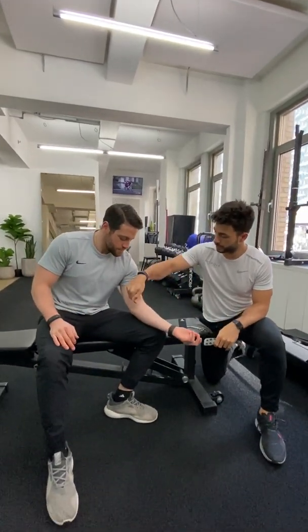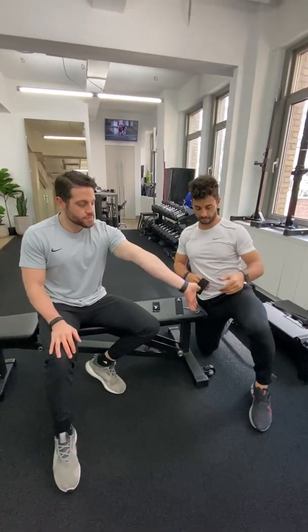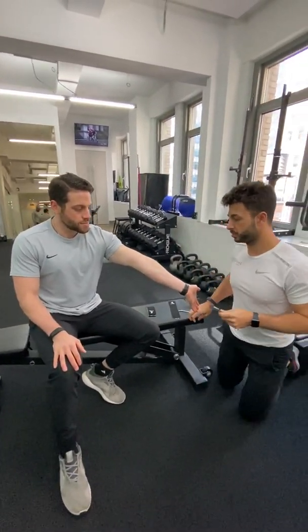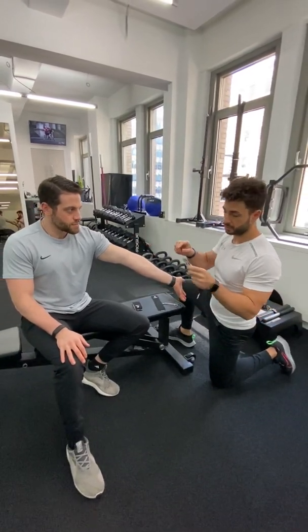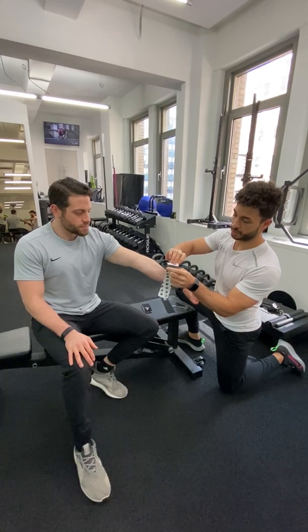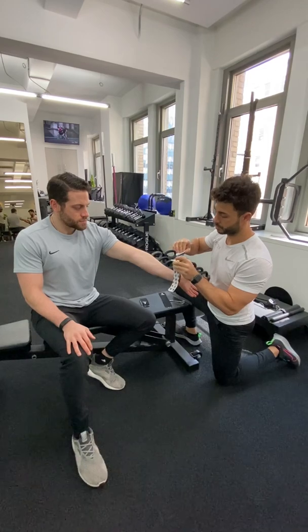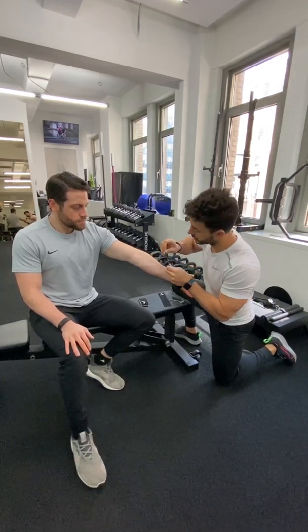So what we're going to do, we're going to really work on his medial elbow. We're going to have him just lift his arm straight out and then bend the wrist down and do a little stretch here. So what I like to do is I'm going to anchor at 0% stretch. I'm just going to pull the tape apart — I'm not going to touch it because there are some oils on your skin. Make sure his skin is clean prior. Make sure there's no lotions on the skin.